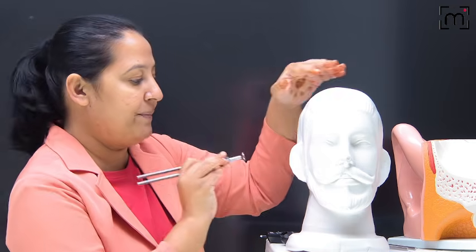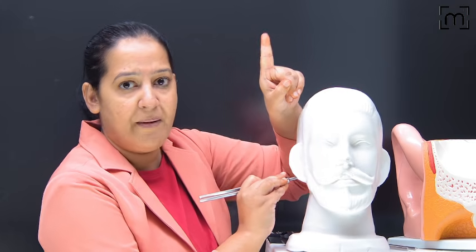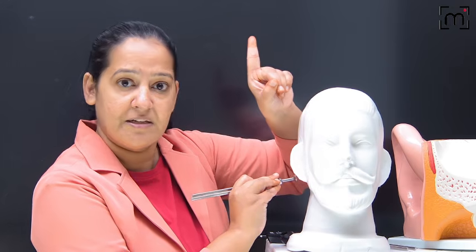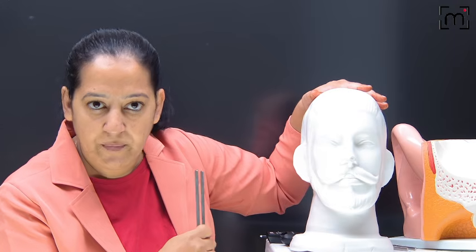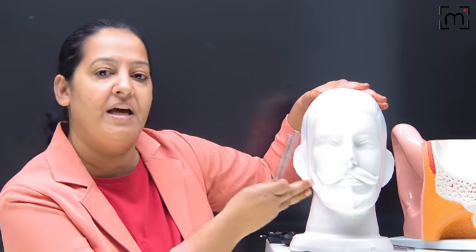So I will take a tuning fork and activate it. I will keep it on the mastoid of my patient. I will ask the patient to tell me the moment it stopped vibrating, by raising the index finger. As soon as it stops, the patient raises the index finger, and the same moment I shift it to myself and check whether it has actually stopped or not. Yes or no? If it stopped, the patient is normal, not having any deafness. But if I still feel the vibration, the patient is not feeling it, the patient said stop, but when I shift it I feel the vibration, so my BC is greater than the patient's BC.